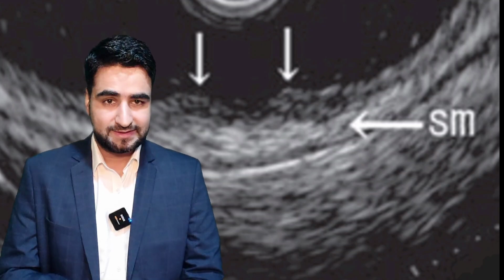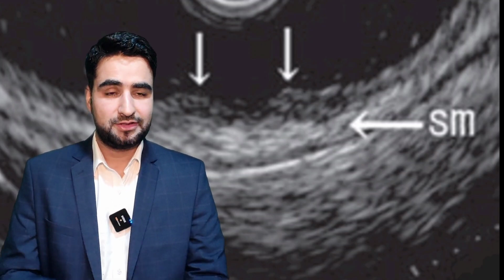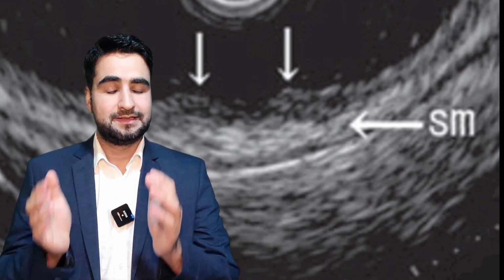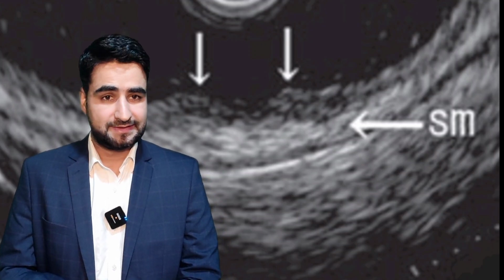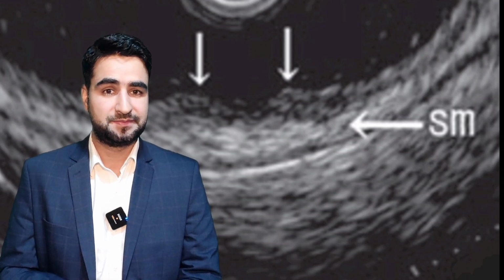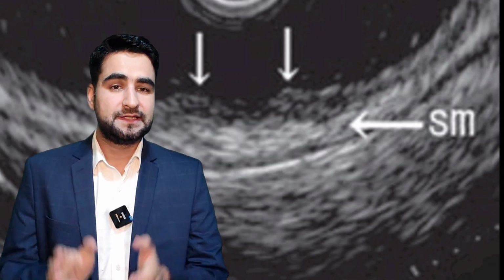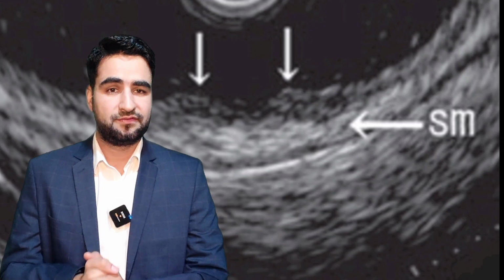Now, in this case, endoscopic ultrasound reveals disappearance of the first hyperechoic layer. There is mild hypoechoic change of the second hypoechoic layer, and there is a normal third hyperechoic layer. This description indicates that superficial layers of mucosa are affected, but the deeper layers, especially submucosa, remain intact. So, what could cause loss of the first hyperechoic layer? This typically suggests ulceration or erosion of the mucosal surface.